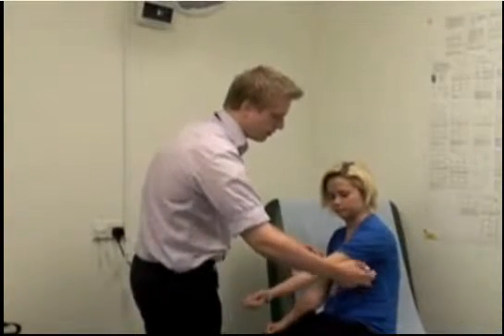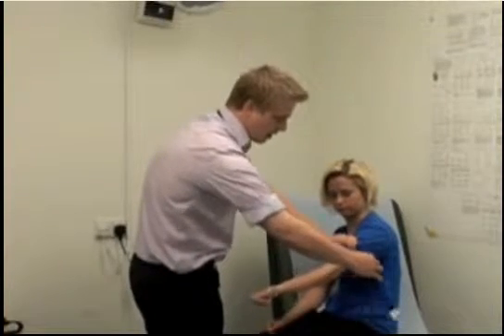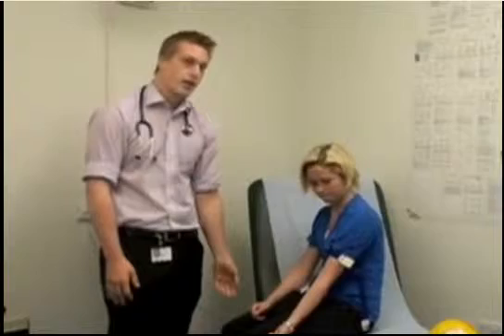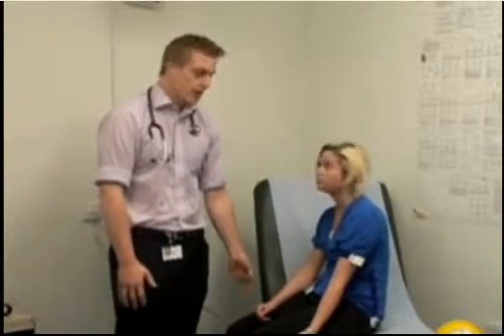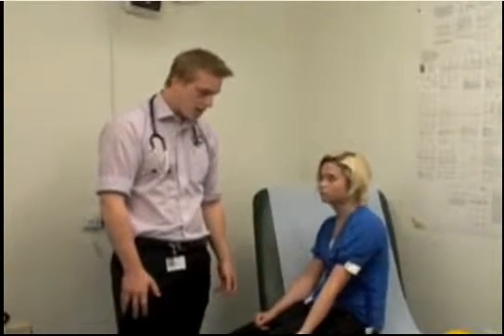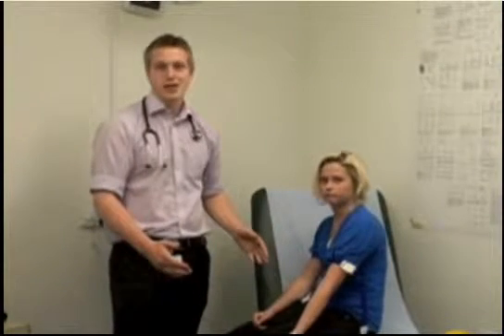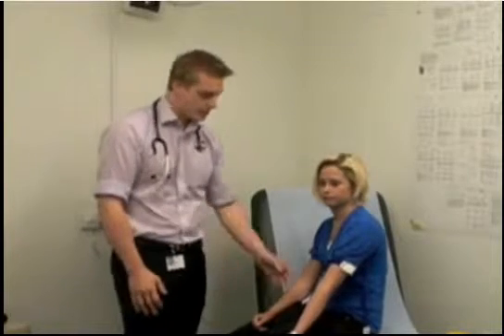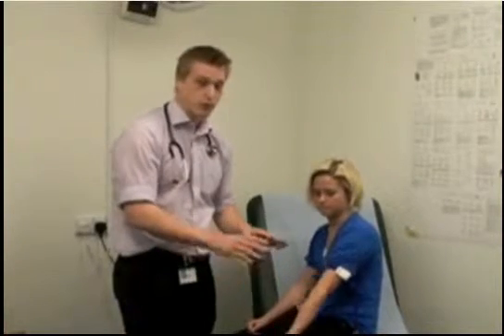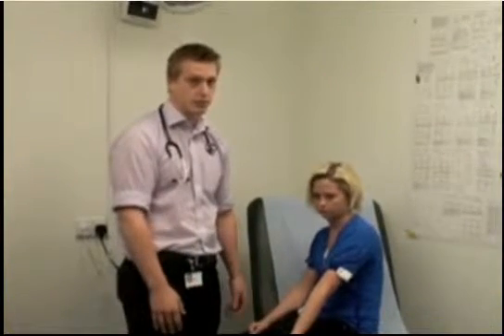Next, apply the tourniquet. The best position is around the bicep — pop it around and tighten it up firmly so the veins start to fill with blood. Ask the patient to relax their arm by their side below the level of the heart, otherwise the veins won't fill. Note that at this stage I don't have my gloves on — this is because it's much easier to feel the veins without gloves, before touching any needles or prepping the patient.